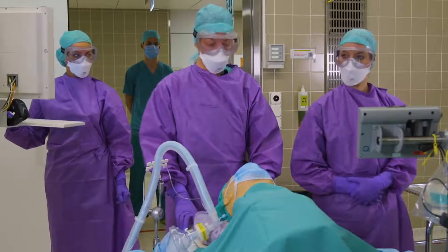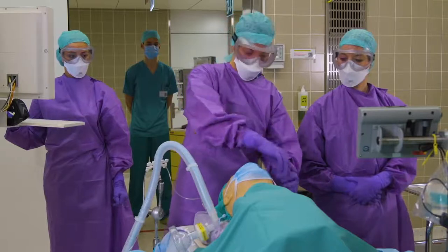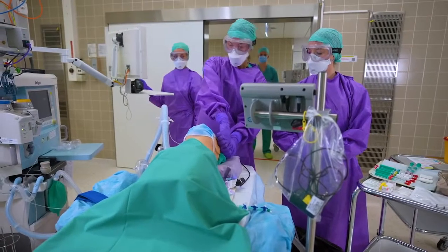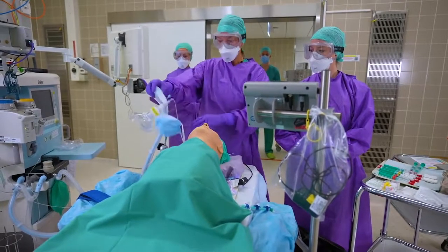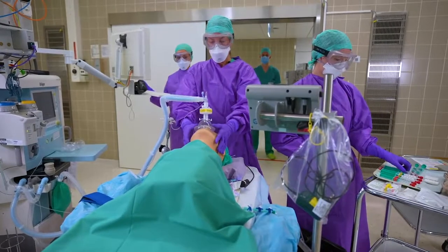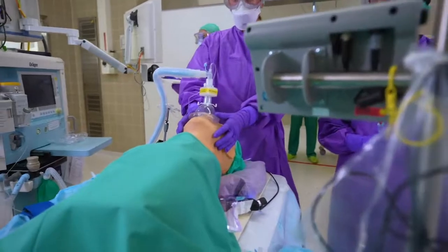We are starting with an adequate pre-oxygenation for about three to five minutes. As you can see, our patient is wearing a surgical face mask, which of course we have to take off. Then we will pre-oxygenate, and here it's important to have a tight-fitting mask to avoid any leakage.